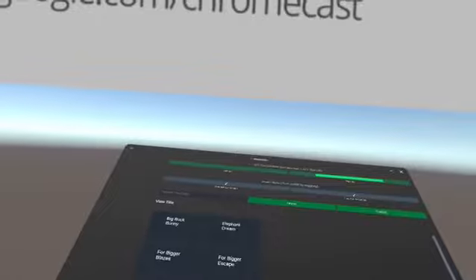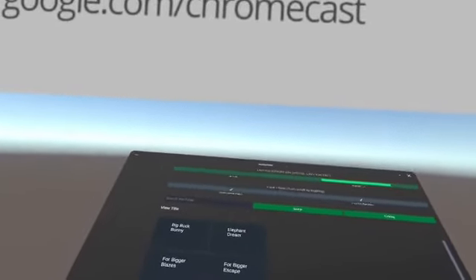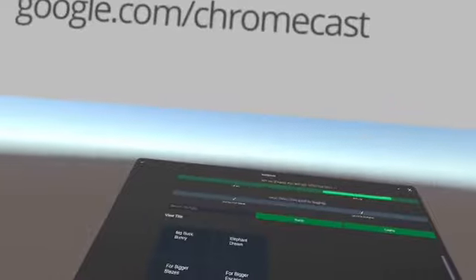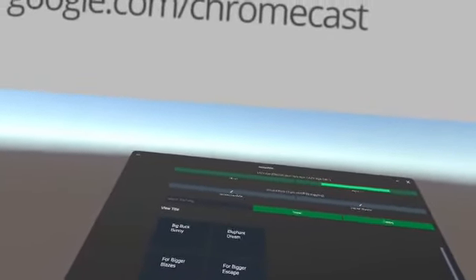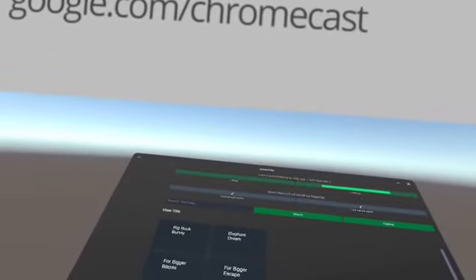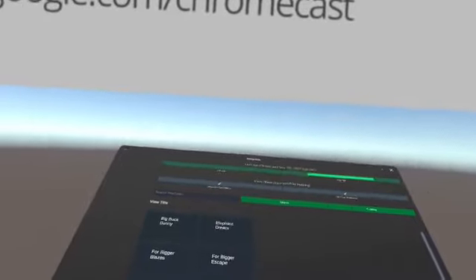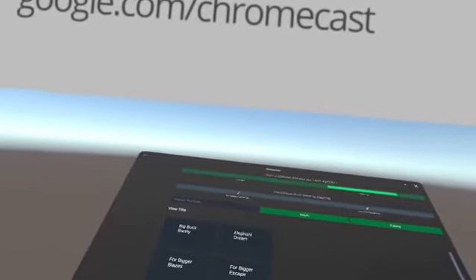You do not get used to the same environment, because it is very important. If you do not change the environment, people get used to the same balls and the same color schemes, and then it works only on your ability of both eyes working together. That only happens if the environment you have created has red and blue with similar shades, but it never happens with natural shading and natural colors. So the effect is very limited.